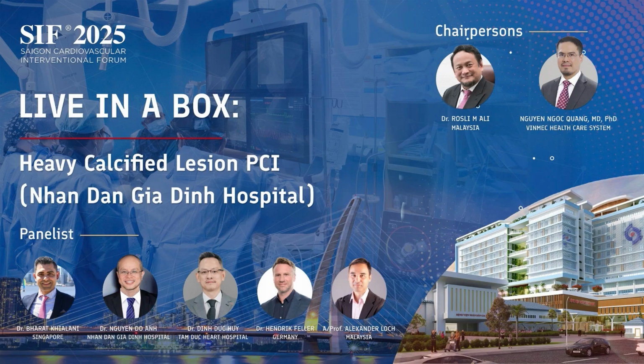The second is that when we see the 3.0 balloon, it is well expanded. If I have the chance, I will use a cutting balloon or NC balloon more. Even at the time I deployed the stent, I did not need to use the balloon, because it makes it more expensive and also has more disadvantages. That's it. Thank you.